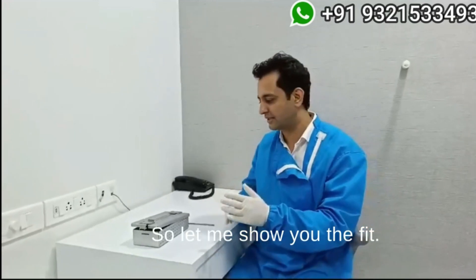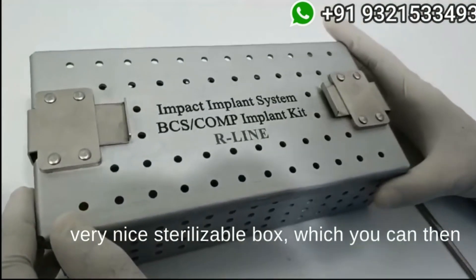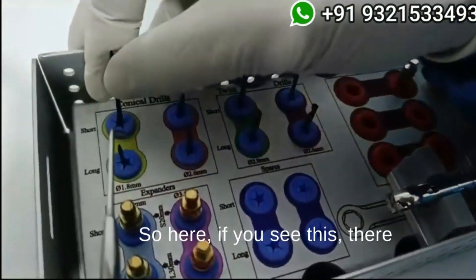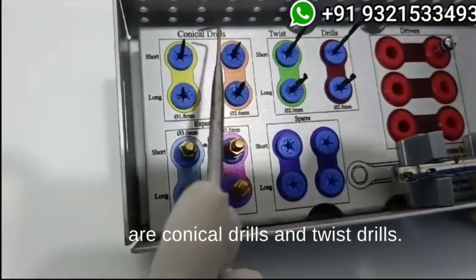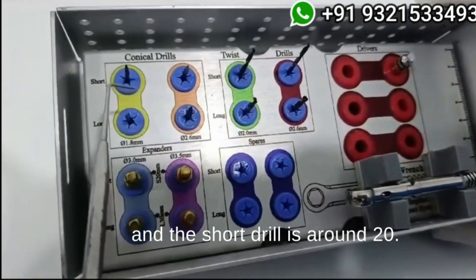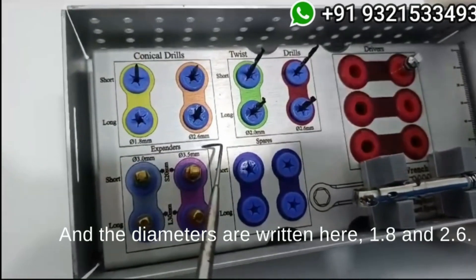Let me show you the kit — come closer please. As you see here, this is a very nice sterilizable box where you can see the arrangement of the drills. There are conical drills and twist drills. The conical drills are available in long and short. The long drill is around 30mm and the short drill is around 20mm, and the diameters written here are 1.8 and 2.6.